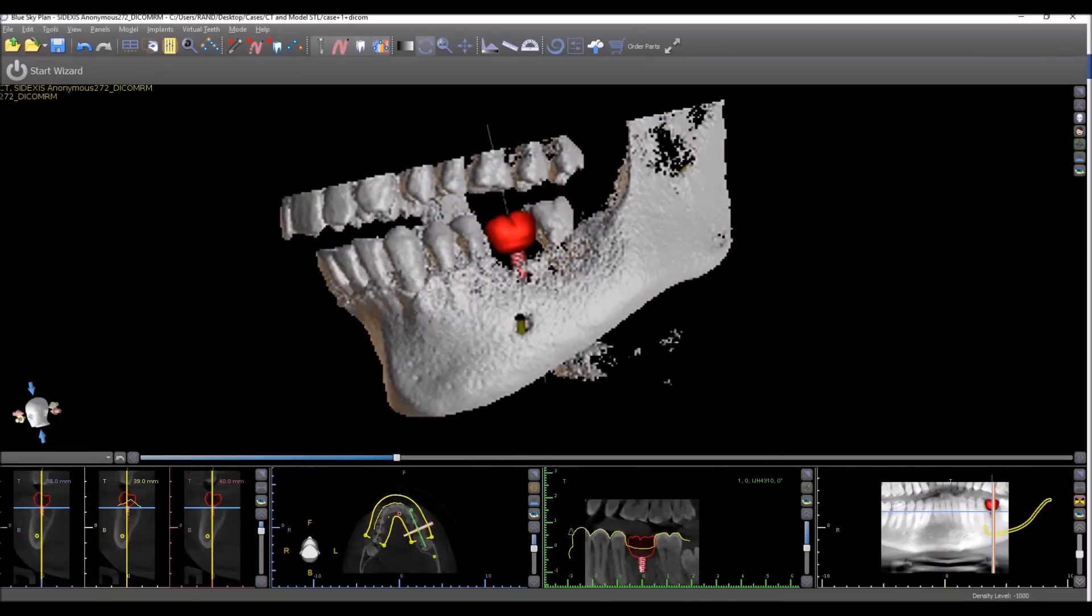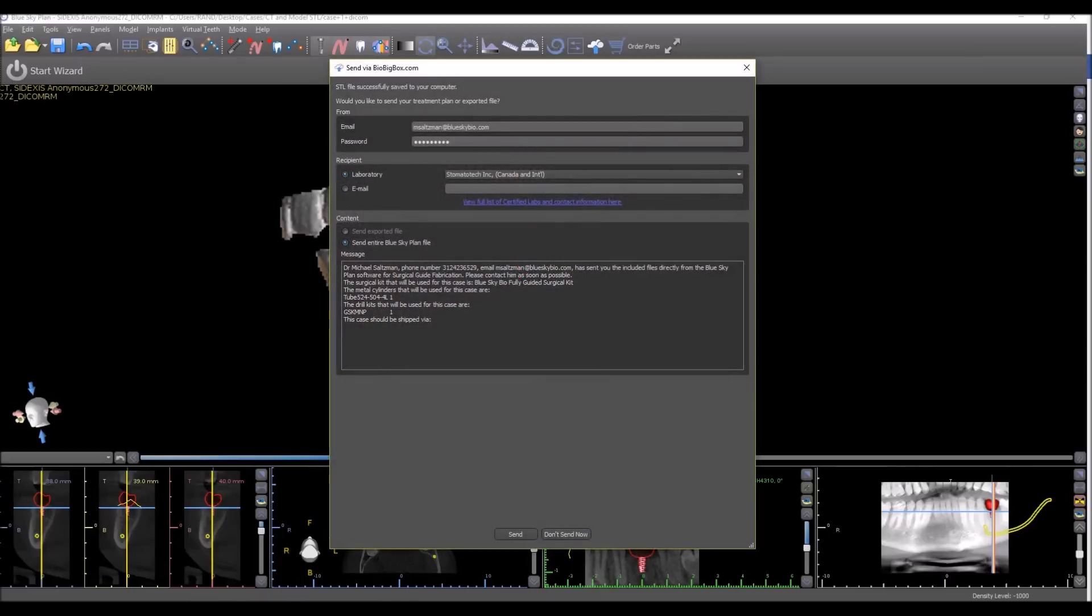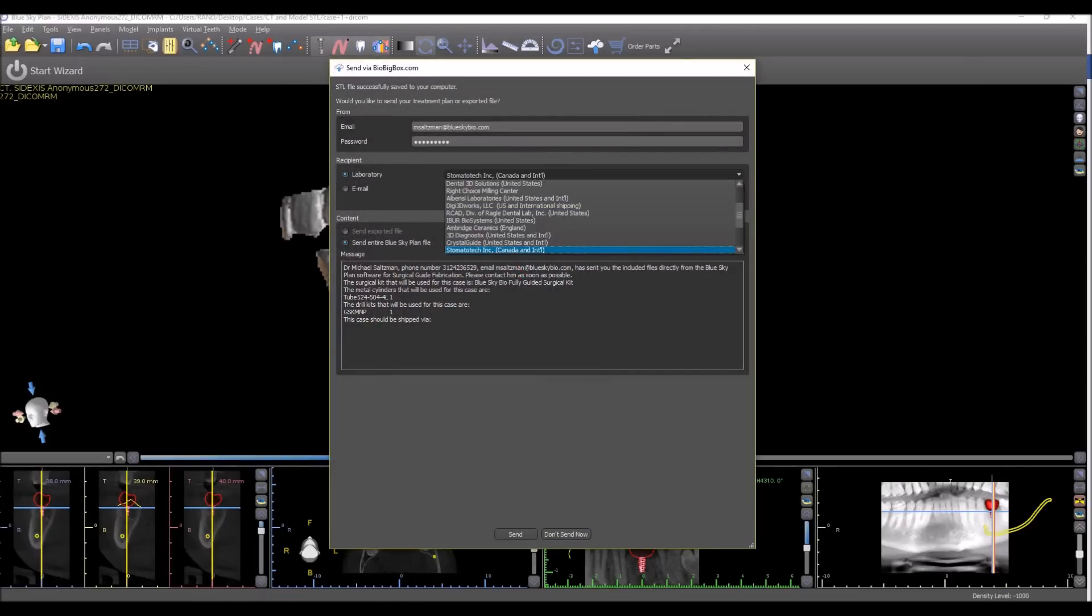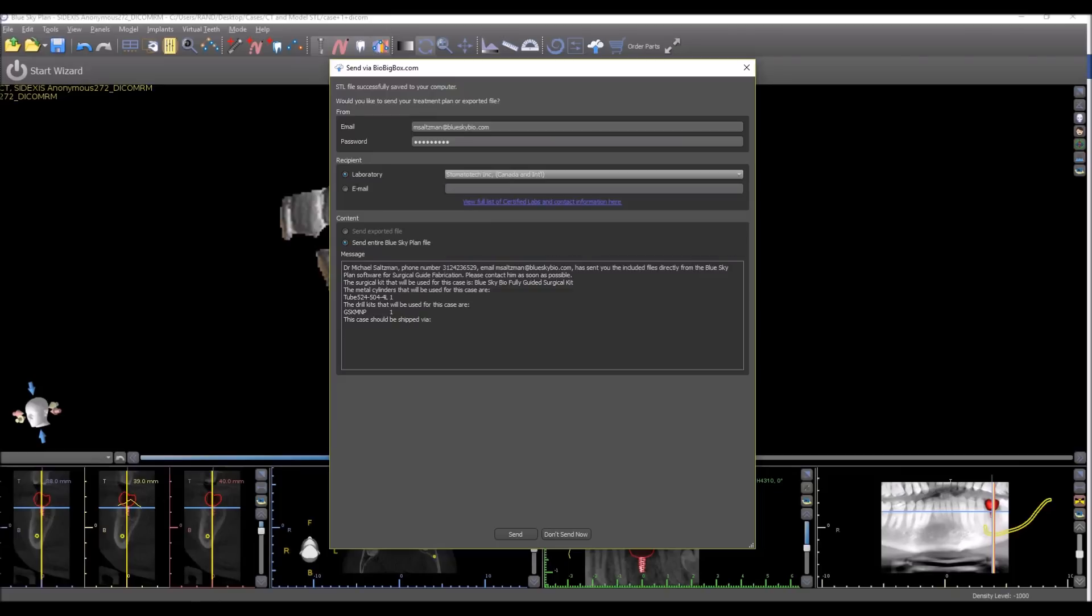We have also improved the send interface via BioBigBox. Here you could see that you can either choose a laboratory from the drop-down list without even needing to know their email address, or you could choose to just enter an email address for anybody and send the case or the exported file to the recipient directly from within BlueSky Plan.